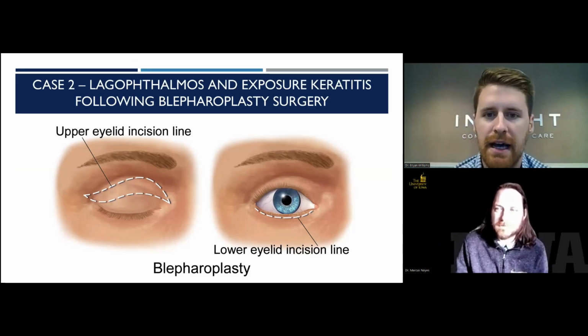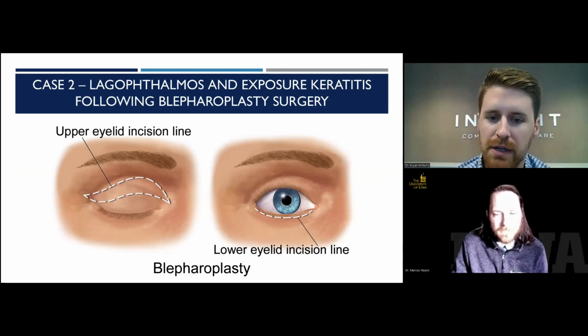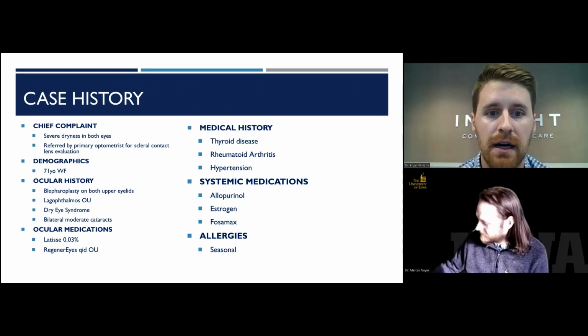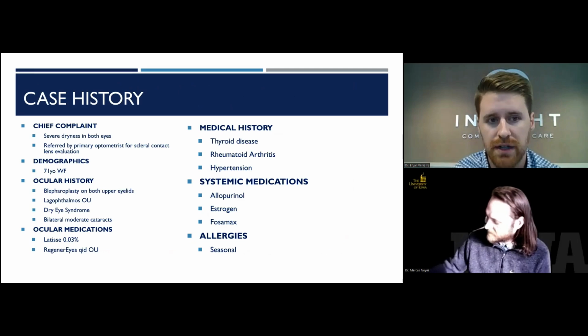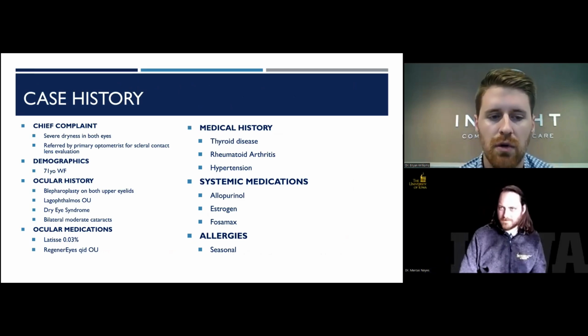But this patient had a blepharoplasty surgery that just took a little bit too much of the eyelids away and kind of ended up with not so great result here. So this patient was sent to me by another optometrist that was following her, trying her with just the kitchen sink of dry eye components for her that just was not getting a lot of great success with. So she had severe dryness in both eyes, 71-year-old white female.